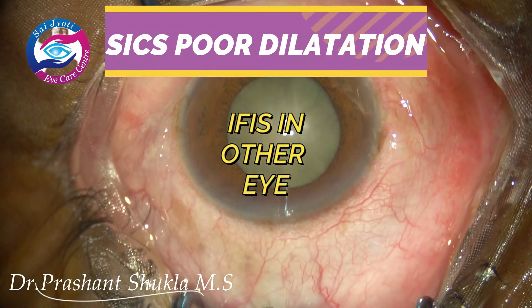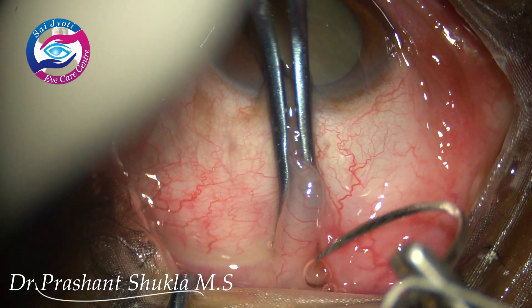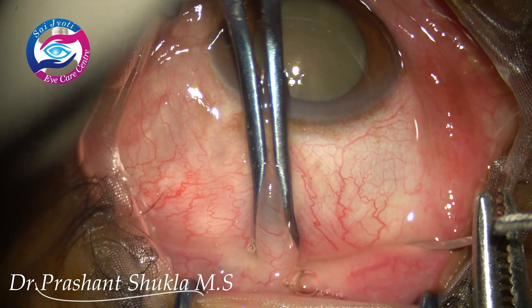Hello and welcome to the channel. This is Dr. Prashant Shukla, and I am here with a case of a 50-year-old female patient. The eye being operated is the left eye.